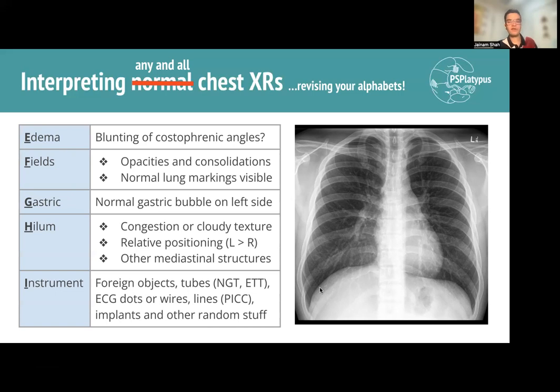For example, in female patients, you might be able to see the bra line. Also, obviously in female patients, you'd be able to see shadowing of the breasts. So just keep that in mind. And you will look really smart if you get to this point and you, for example, notice that this patient is supine, they're probably on a bed or something. They've still got their ECG wires and things like that attached. Like they've got a lot of stuff attached to them.